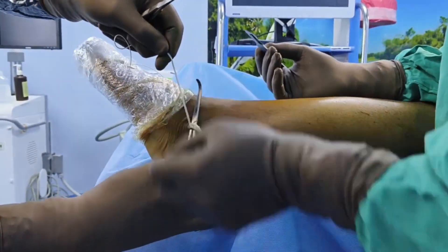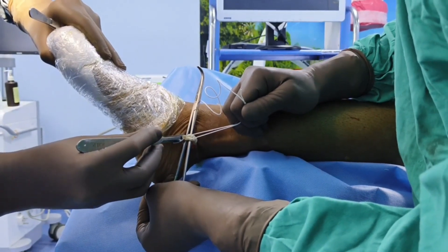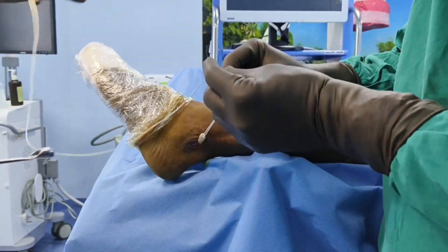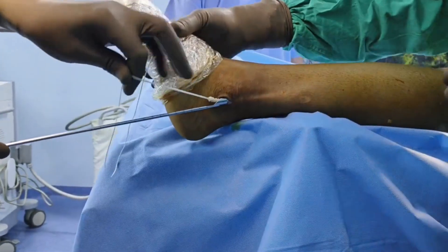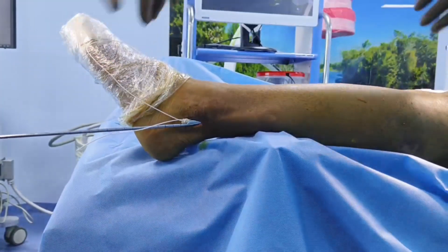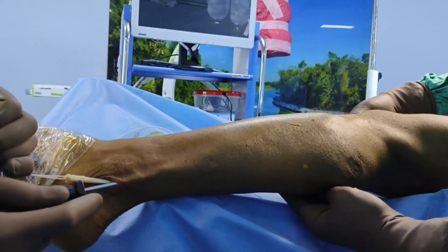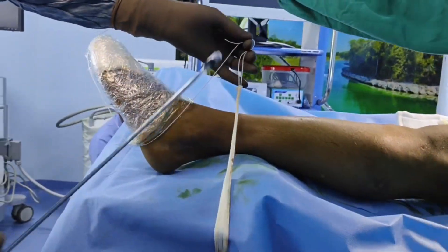Once this is done, cut the tendon between the Vicryl and the fiber wire suture — the distal end of the peroneus longus is cut. Now the tendon is free from the distal side. Then take the tendon stripper — there are two types: closed end and open end; this is the closed end tendon stripper, closed from all sides circumferentially. Pass the tendon through the stripper, pull the threads with one hand and push the stripper with the other, flex the knee slightly, and take the leg to the edge of the table. At the musculotendinous junction, the tendon stripper will automatically cut the tendon.